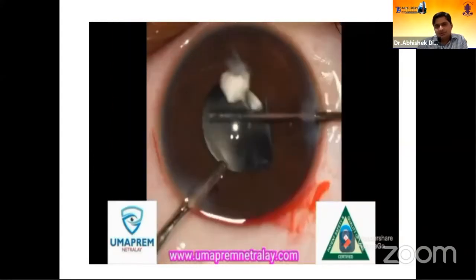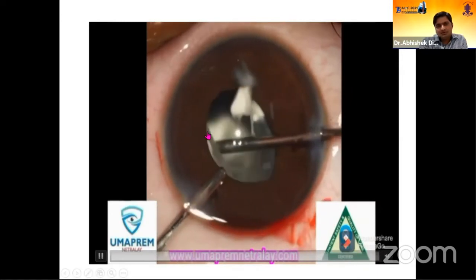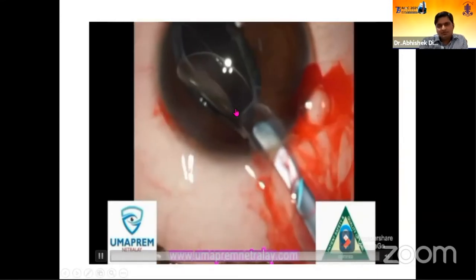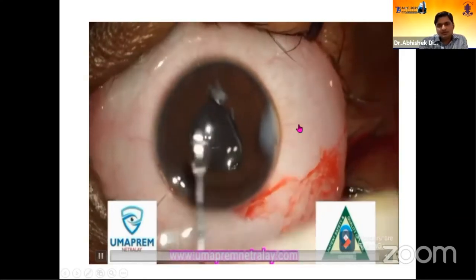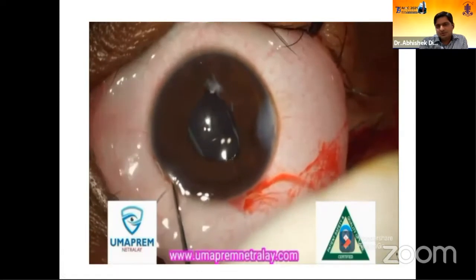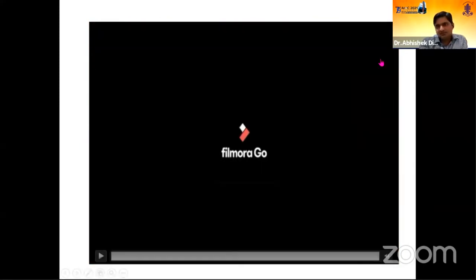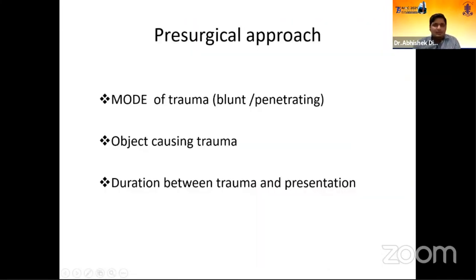We performed the anterior vitrectomy — you can see one small chunk of vitreous went inside as well. After completing the anterior vitrectomy, we placed the three-piece IOL in the sulcus and closed. Post-operatively, the patient's vision was around 6/60 with astigmatic glasses.